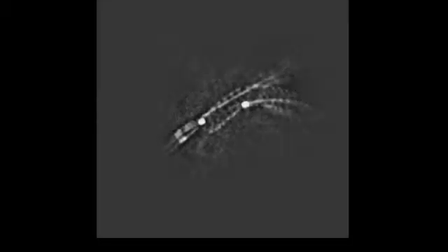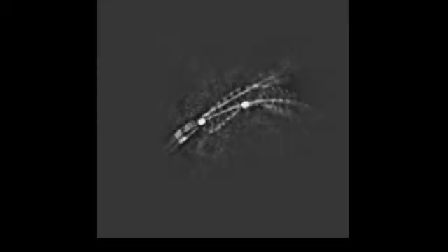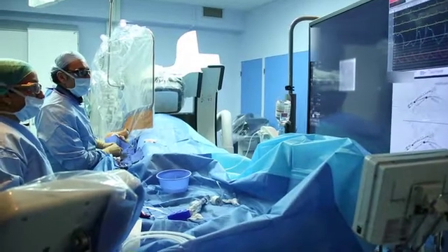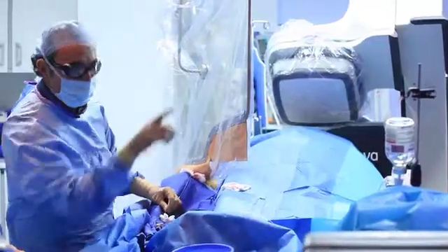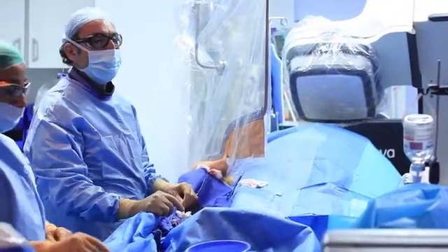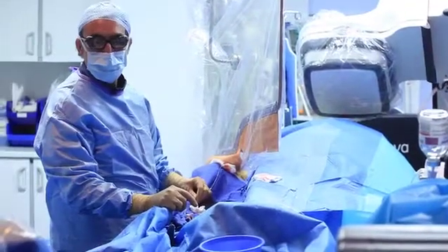Because we have to cover the carina to do a good POT. As you can see here, the balloon is too proximal — we don't cover the carina. So here we are. We have a better place.